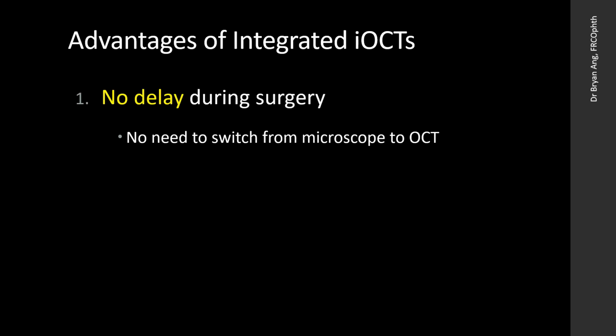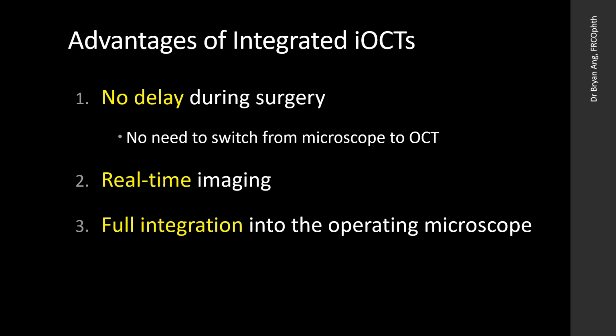These integrated iOCTs brought with them several advantages over the portable iOCTs. These included less delay during surgery, more real-time imaging and less time lag, and as mentioned, they were now fully integrated into operating microscopes, creating much more stable combined platforms.